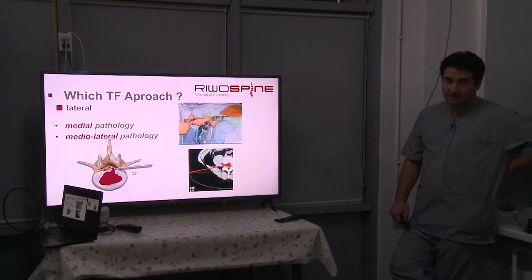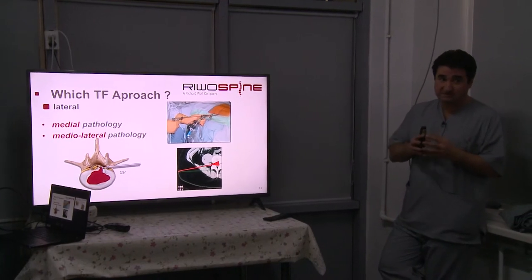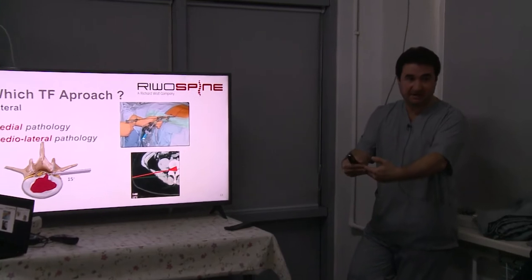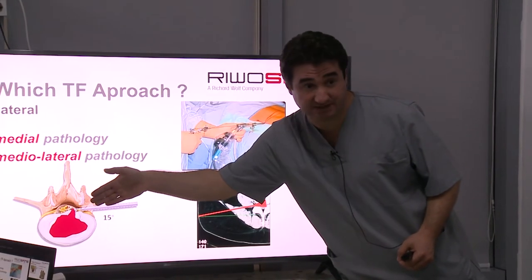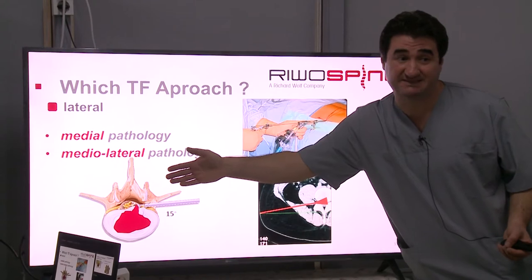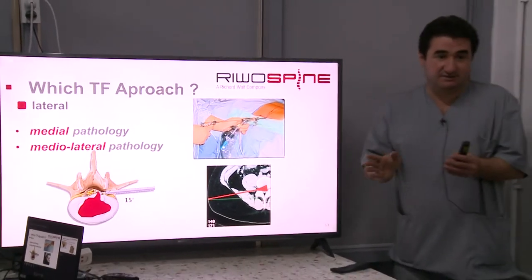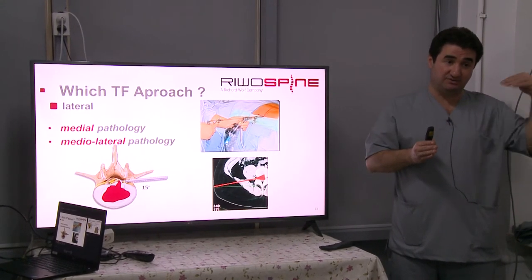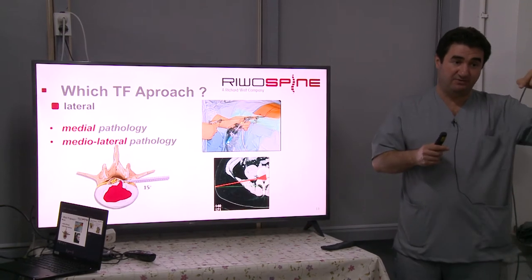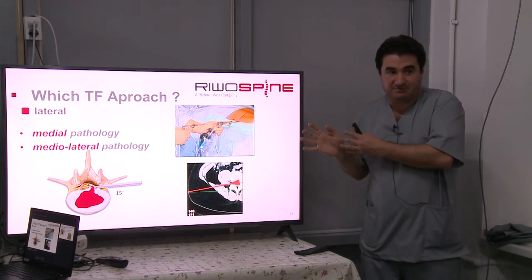Because the hypertrophic facets usually compress the traversing nerve root. For example, the hypertrophic facet of L4-5 always compresses the L5 nerve root inside the spinal canal. And to reach here, if you go interlaminar, you have to resect almost 50 or 60% of the facet joint. Then we always prefer to come like that. Also there is a pedicle there, and usually we see the compression on the caudal side of the recess, just medial to the pedicle. We prefer to also resect the caudal lamina, like a fenestration. But with the transforaminal approach, it's not possible to do that.